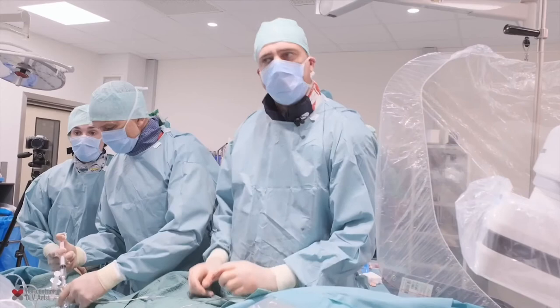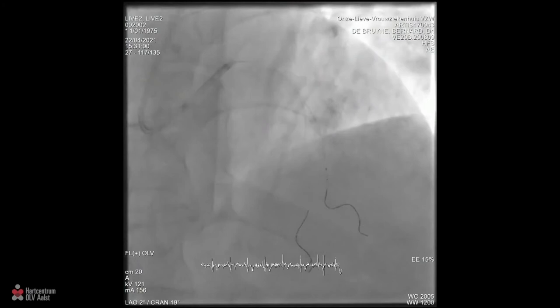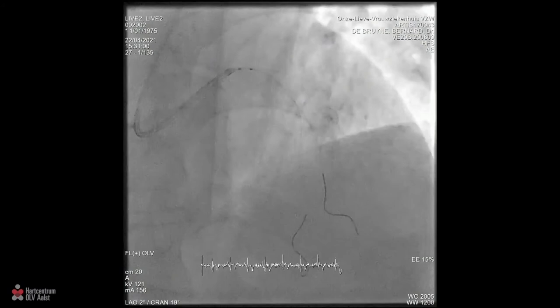So we stented the diagonal branch, or the side branch of the diagonal branch, and we're going to do an intermediate FFR measurement distal to this stent. We all agree that we will also measure, of course, the contribution of the proximal LAD, but we already dilated there, so we'll see what happens now.